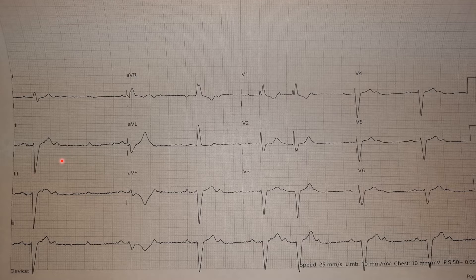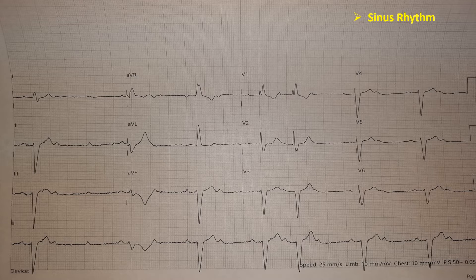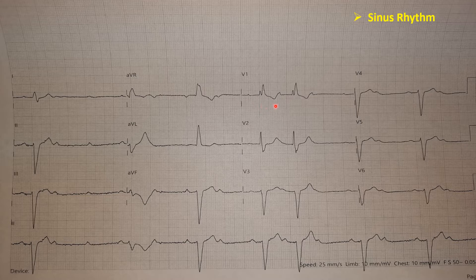Now, what is the rate? The rate is somewhere around 90 to 100 beats per minute — so the P-to-P sinus rate is around 90 to 100 beats per minute; it is not that fast. Next, we have to see the morphology and the conduction into the QRS. For that, we have to look at lead V1, because that is the lead which shows the morphology — it is very important to identify the QRS morphology in lead V1.